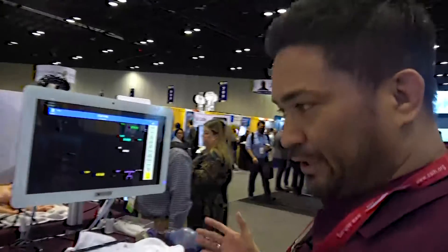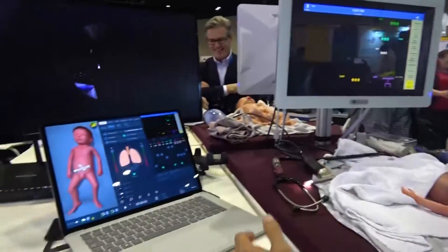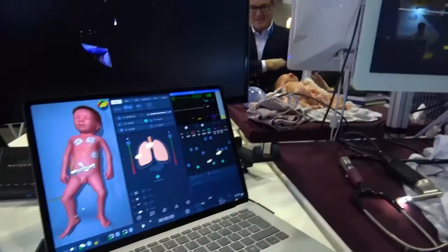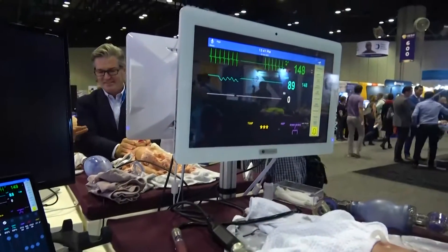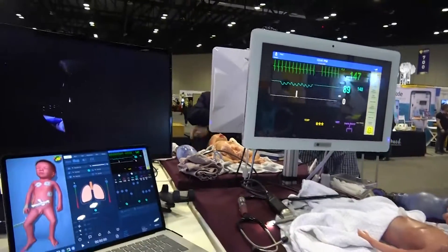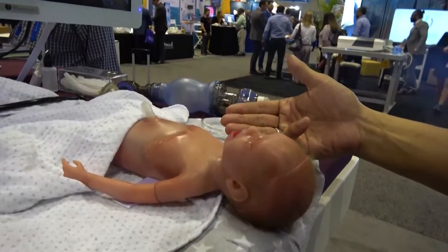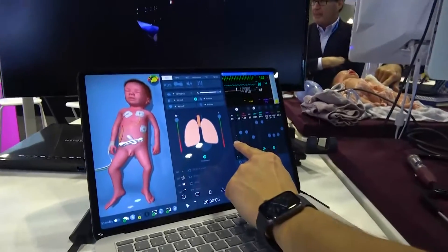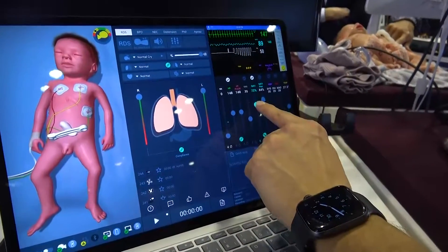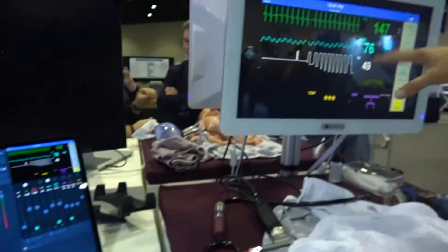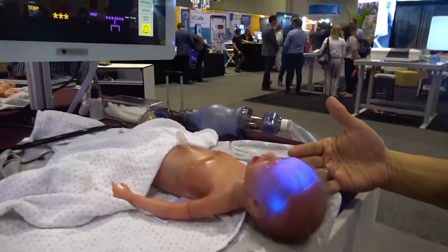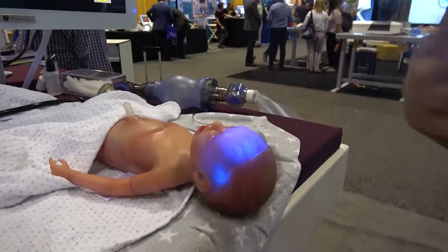Paul is a high fidelity simulator. He does fancy things. We can turn on the EKG in the monitoring, we can turn on the saturation. Paul has spontaneous breathing now, you can see. Everything's working fine with Paul, but we can also let Paul have a problem — for example, Paul has no spontaneous breathing, and we can see in the monitoring that vital signs are going down. Paul will go down with his saturation, he gets hypoxic, and now we as medical professionals need to do something to help Paul.